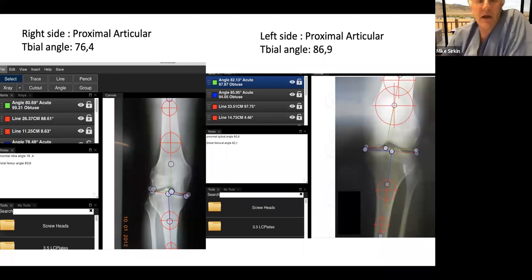I do want to point out the nice use of what Raul Veda showed us, which was using this hip center tool, both on the femur here. And this is a good way of just getting the center of the femur here so that you can drop the line down, and doing the same thing with 2 points on a tibia. And then this way very nicely gives you the long axis of both the femur or of the tibia, as well as done on these shorter x-rays on the normal side on the left side.